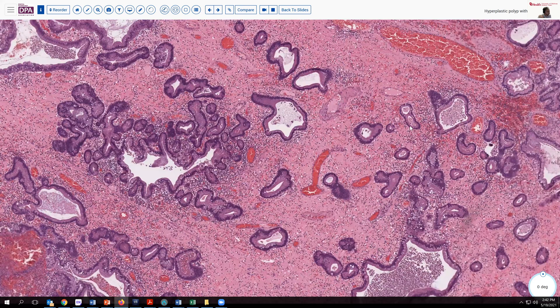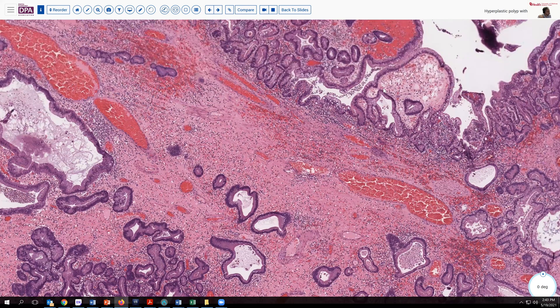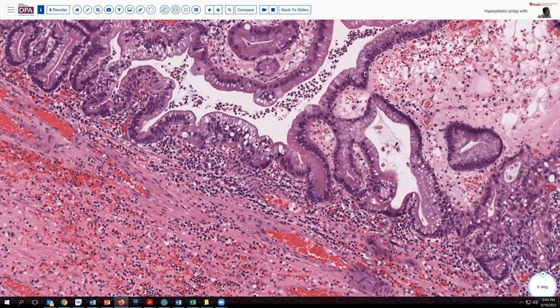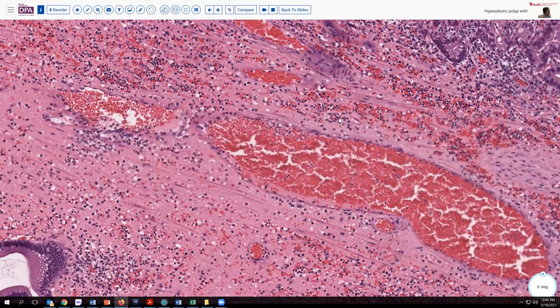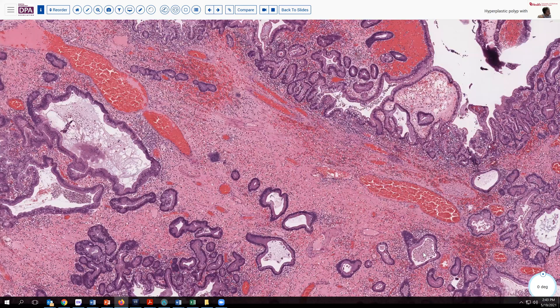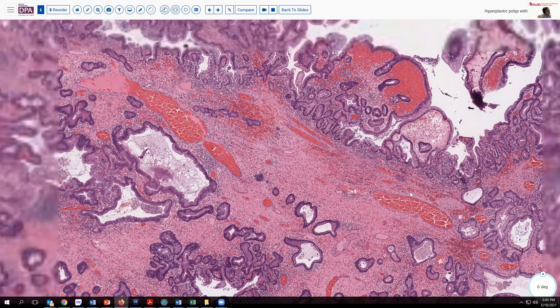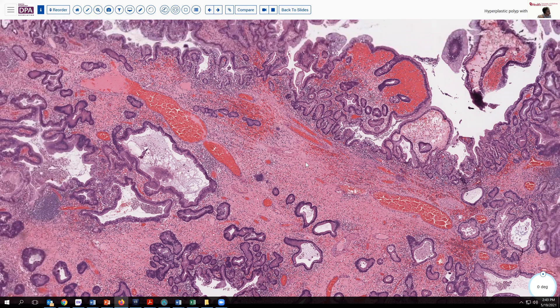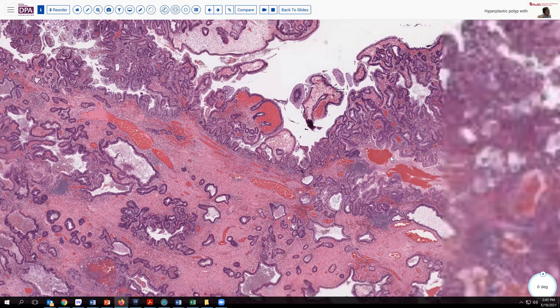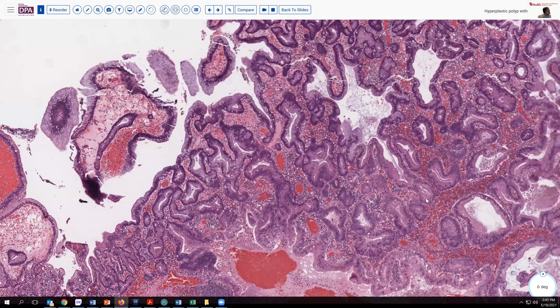Looking at these glandular elements, they appear to be a fairly uniform cell type. On the surface we see foveolar type cells, and that's also what is present in many of the deeper portions of this lesion. So we're looking at foveolar type epithelium with an inflamed and edematous stroma without much smooth muscle. Let's look at some of the more cellular, bluer areas to see if we have evidence of dysplasia.